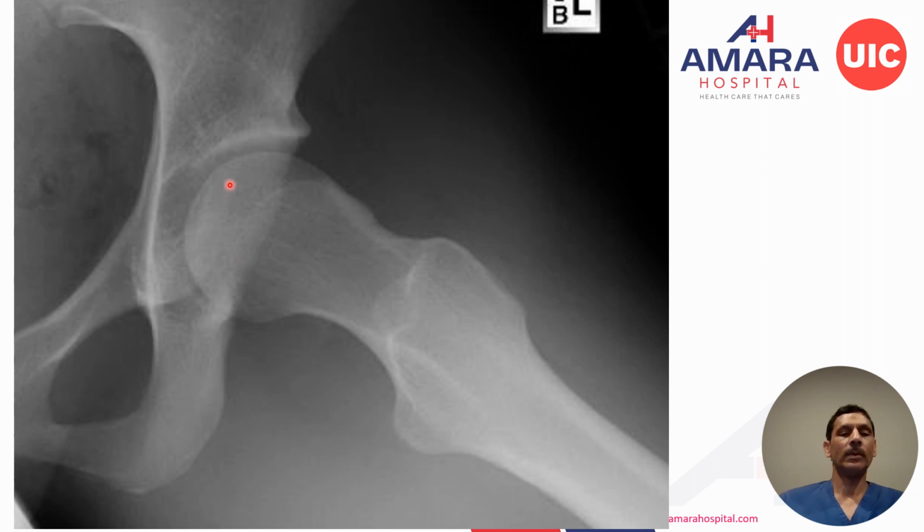Lateral view, the femoral head has nice contour in the back, but does not have much of a contour in the front, almost like a straight line with no neck concavity. There's actually a bump anteriorly in the neck. So ideal morphology will be more like this. So all the bone that's beyond this line is excess bone, a risk factor for cam impingement.